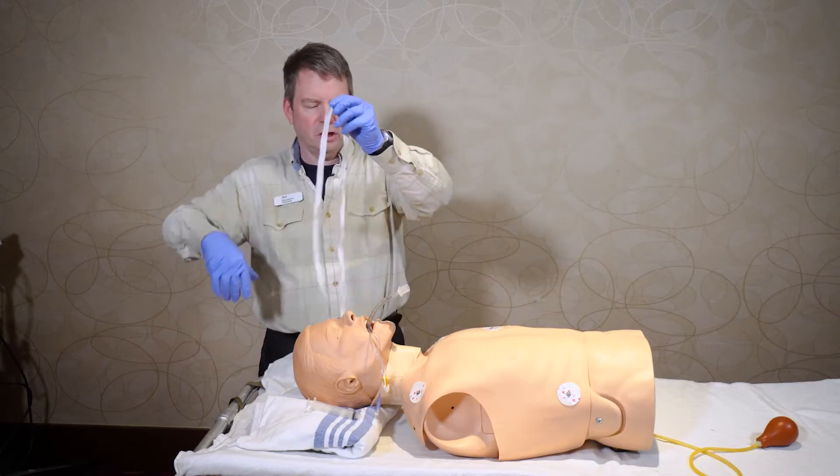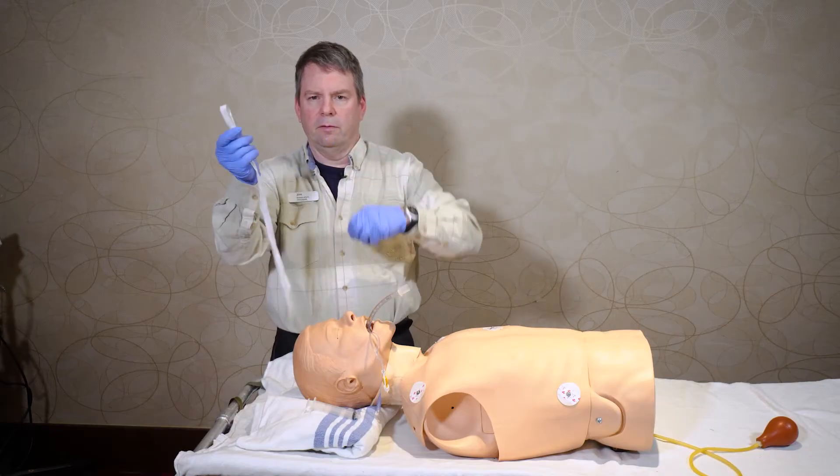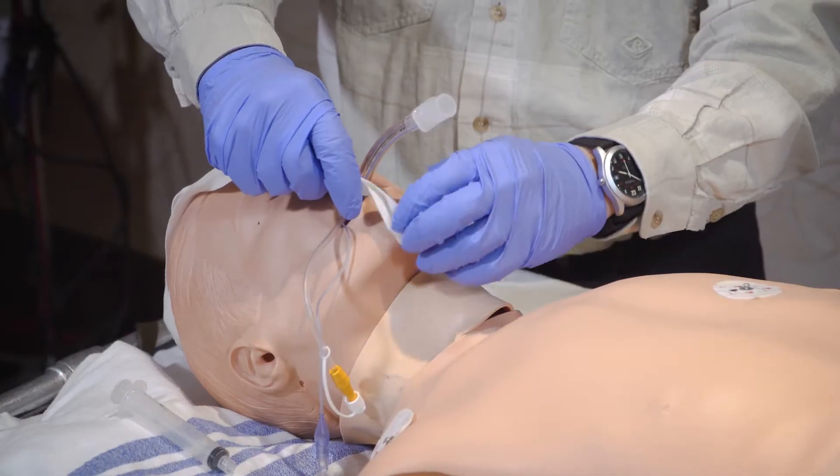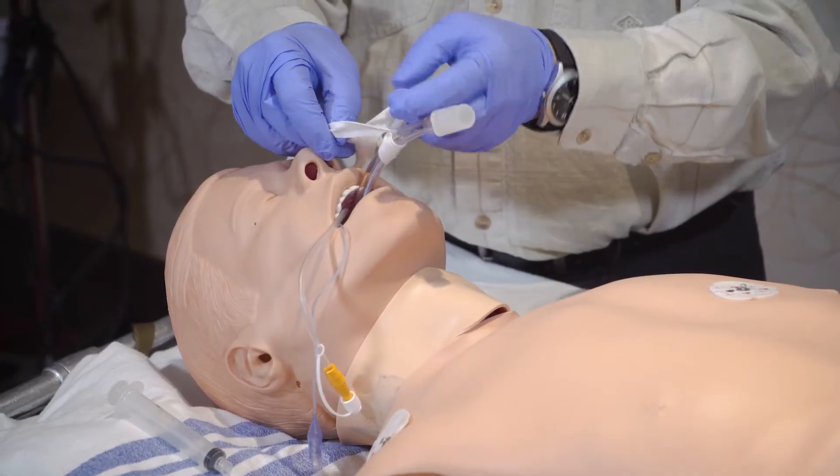Fold it in half, and then with it folded, take the loop around the endotracheal tube and pull the two ends through that loop that you made.